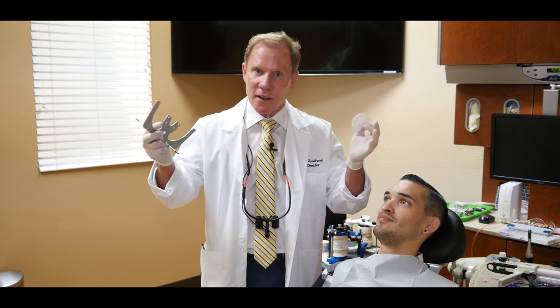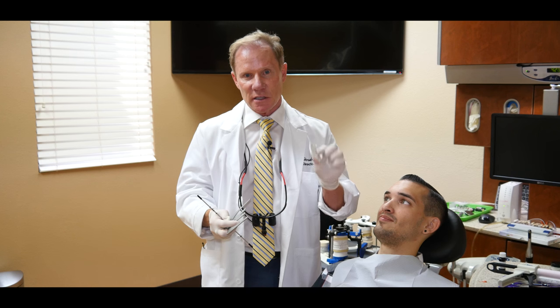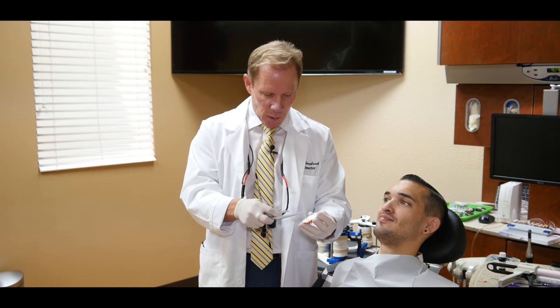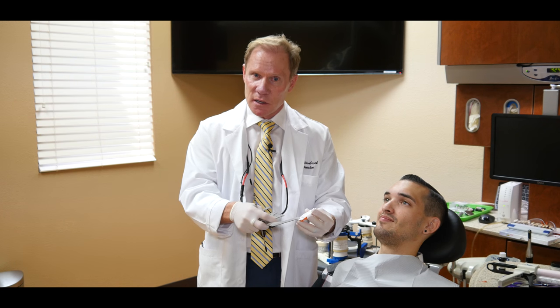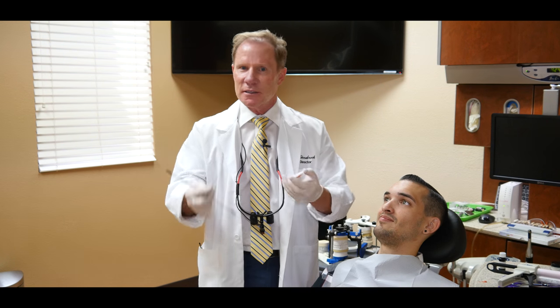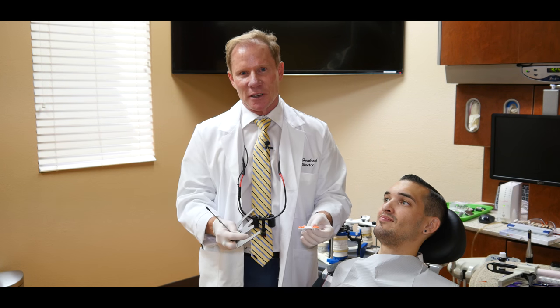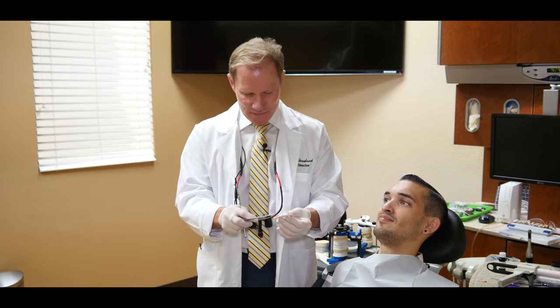If you have multiple cases from your office, instead of having three or four or five traditional earbows that can run up to $400 to $500, we have these little plates that are very, very affordable. Lots of times I'll take just a Sharpie felt pen and write the patient's name, just in case something gets mixed up in the laboratory and they don't know which plate goes with what model. Or maybe we do it in our office.